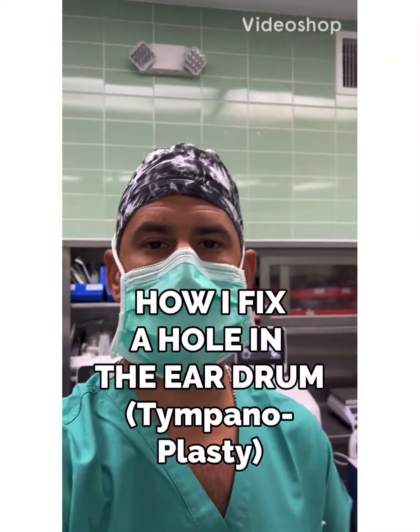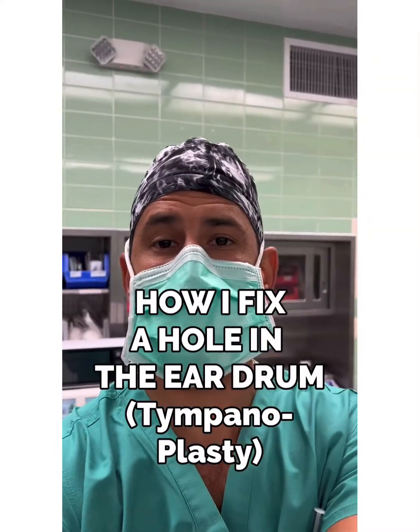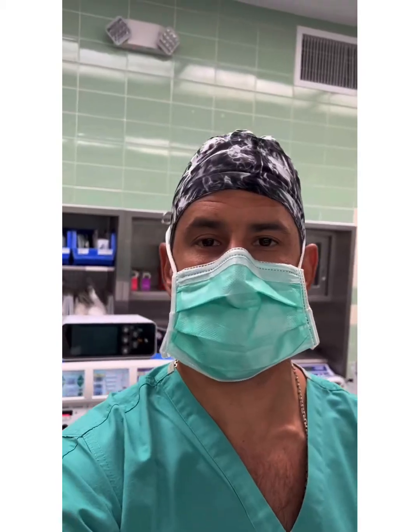What's up everybody? Happy Friday. We're doing some ear surgery today. I want to show you guys how we set up for ear surgery.